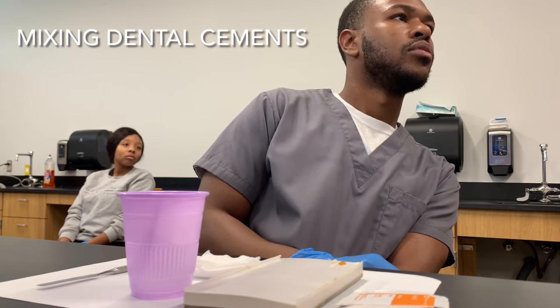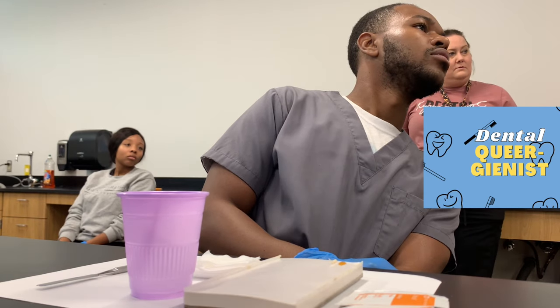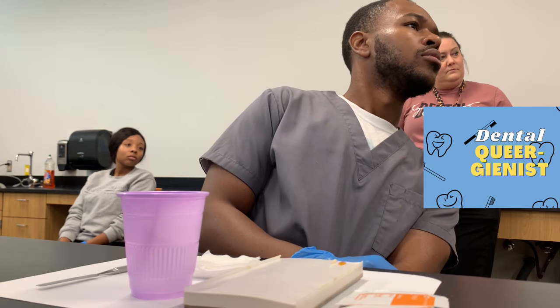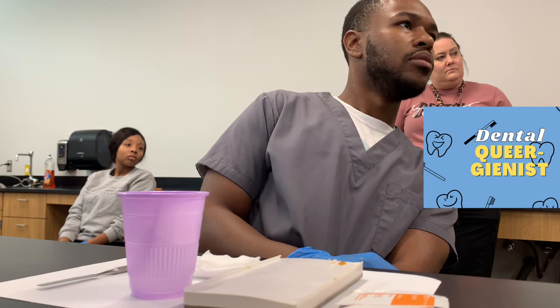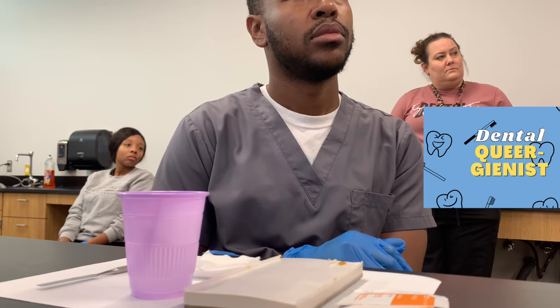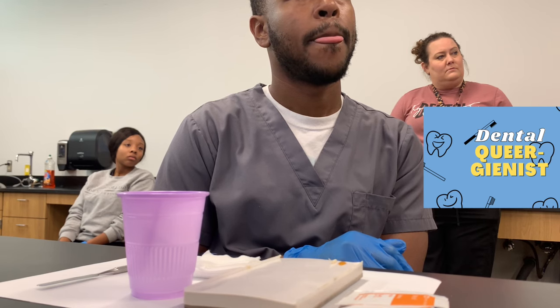Just scoop it up, bring it together, and start blending it. The working time on this is 30 seconds — it won't take you that long. If you spend too long mixing it, it will start to set up. Mix it until it's creamy and all blended together. If you don't see one color over the other, then you're good — you can line the inside of that crown.